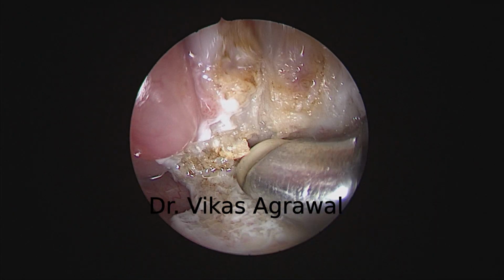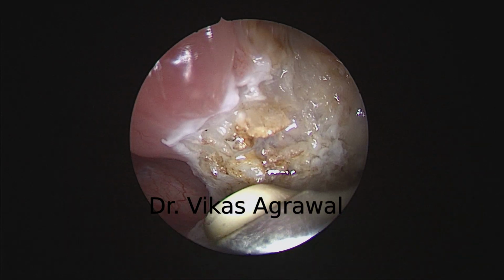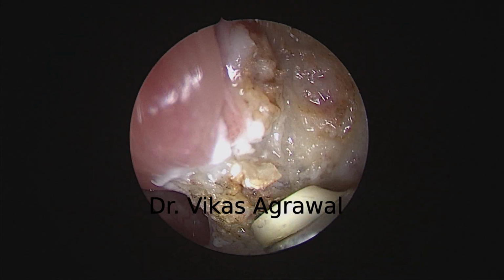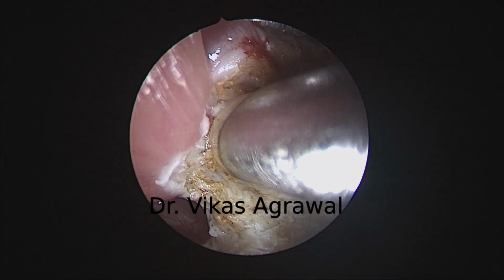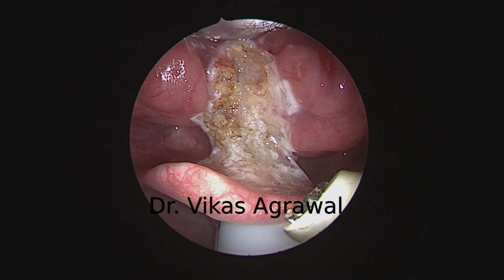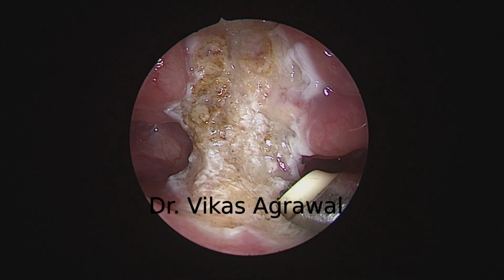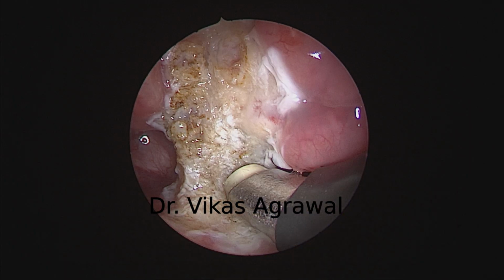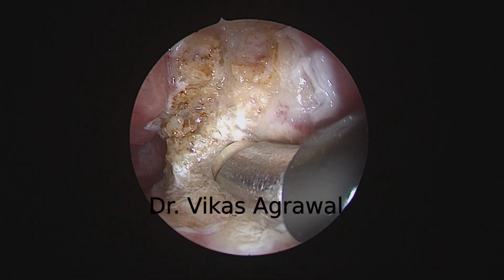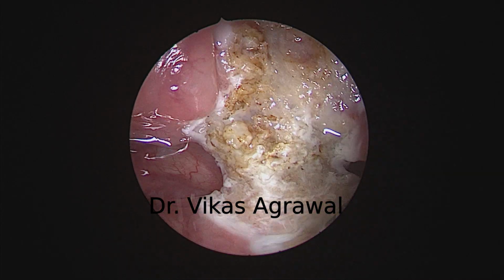And using a 70-degree scope, you can use a 45, you can also use a 30, but 30 becomes a little challenging. 45 and 70 are much better. 45 is the ideal. So this is glossoepiglottopexy. You need not coagulate this area. All right. Let me see if I need to do a little more. Not really. I have already done maximum. I'm giving a good amount of energy into the median area.